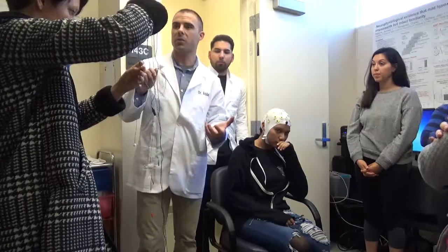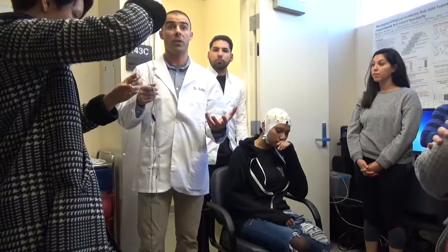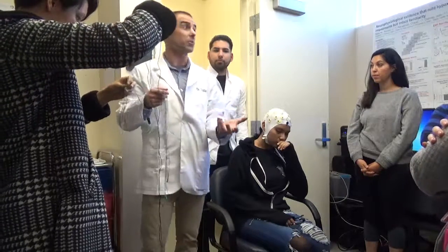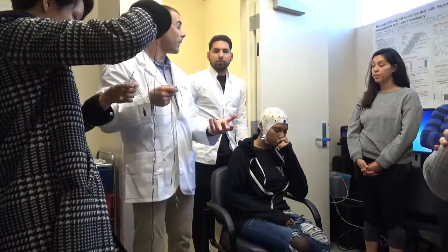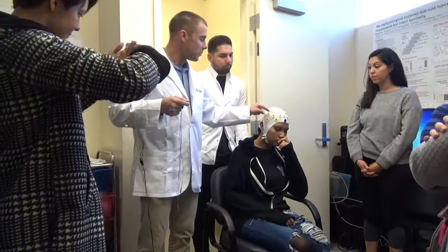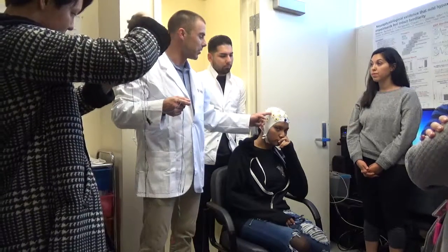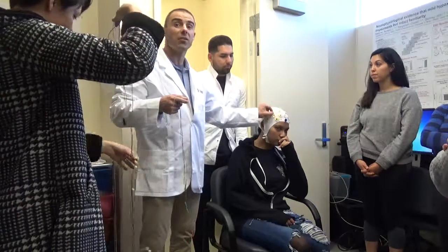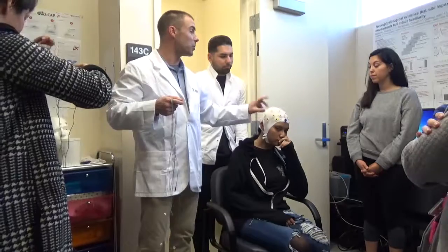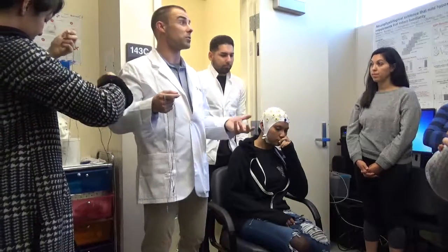So there's something called a salt bridge that you want to avoid at all costs. So the gel is salt, right? And the whole reason we're using it is because it conducts electricity from point A to point B. So if you put too much gel in this spot and it leaks out beyond here, and you put too much gel in this spot and it leaks out beyond there, now they've bridged together, and this site now becomes one site because you can't differentiate the electrical signals, and you basically ruined your time.